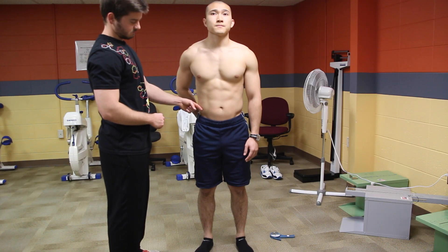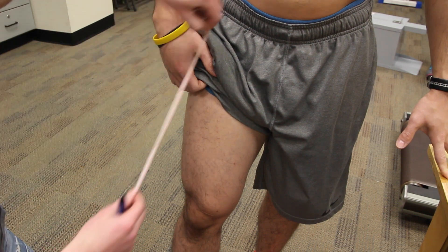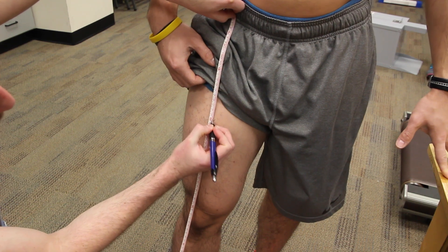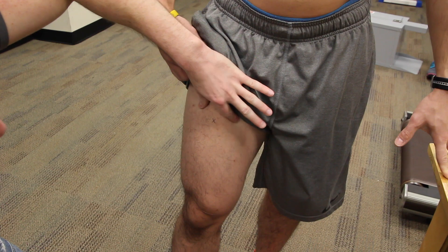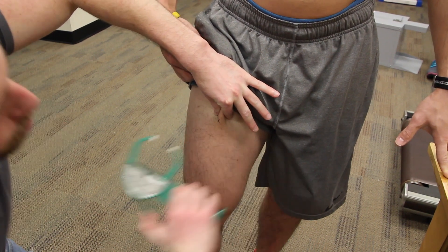The final site will be the thigh. For the thigh site, you're going to measure the distance from the inguinal crease to the proximal border of the patella and mark the halfway spot with an X. Come in for a vertical fold, obtain your reading and release.